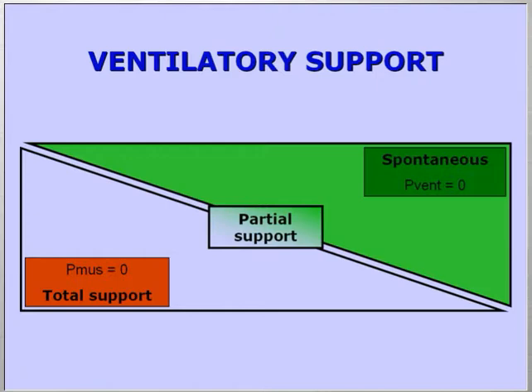It's important to keep in mind that with almost any mode of ventilation, you can really go from there to there. The way the patient is working depends on the mode you have chosen, but much more on the way this mode is set on the one hand, and on the specific ventilatory demand of the patient on the other hand.